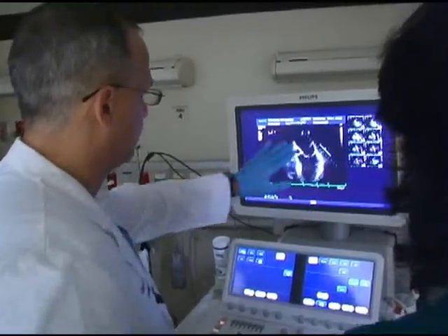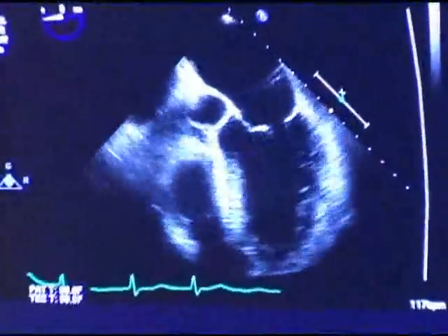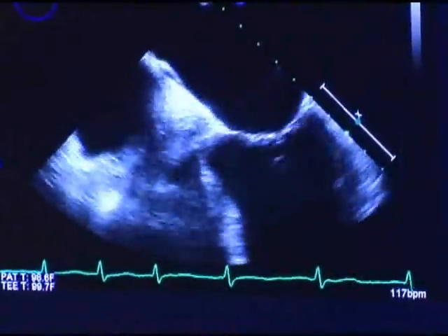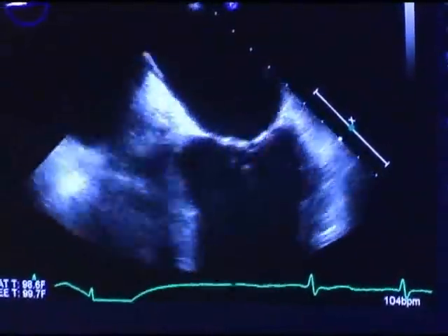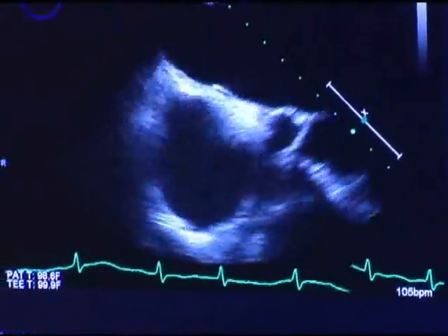Right away, looking at the first view — the left atrium — we're looking for blood clots in there, and we can actually adjust things so that it can be magnified. We don't see any blood clots at this point, and this is good.